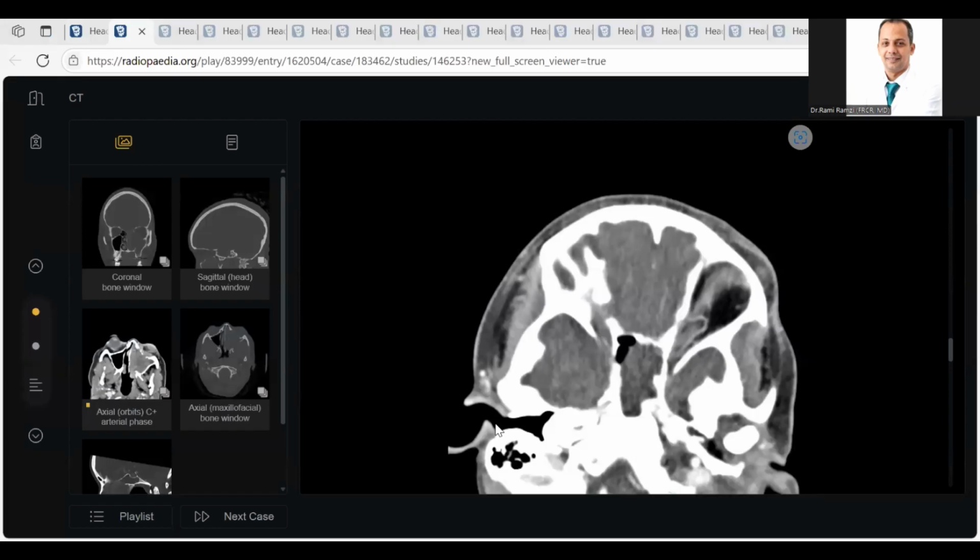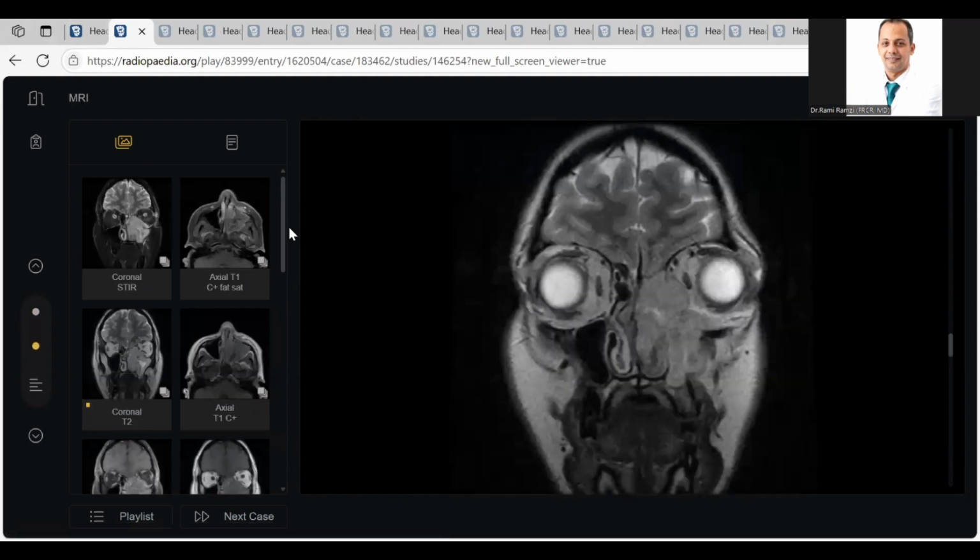This is an aggressive lesion with significant bone erosion and destruction. Age is 20 years. In this young patient, I would keep infection as my first differential, with second possibility of a malignant transformation.